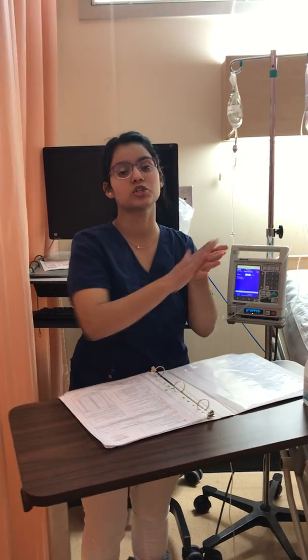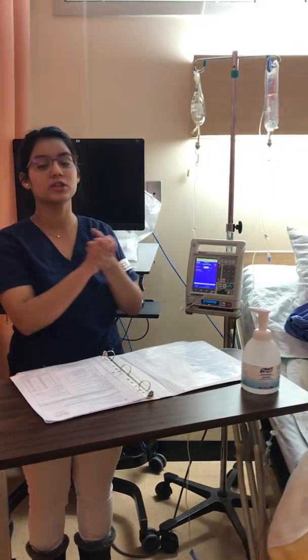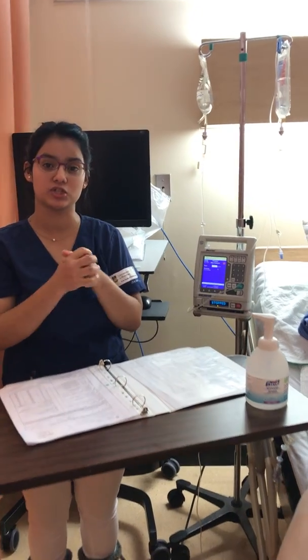My name is Rika, and today I will be showing you how to administer heparin through continuous infusion and how to do a chest tube dressing change.